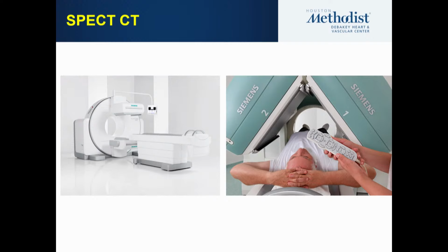So first I'm going to try to give you a little bit of the differences between the PET scanner and the SPECT scanner: different energy, and we utilize different crystals so that we are able to capture the information about perfusion in these patients or about where the uptake is.